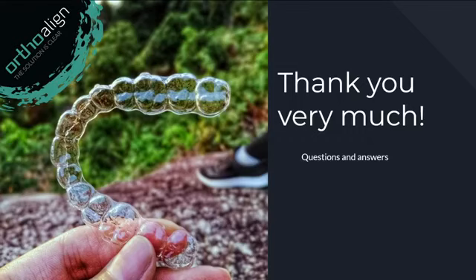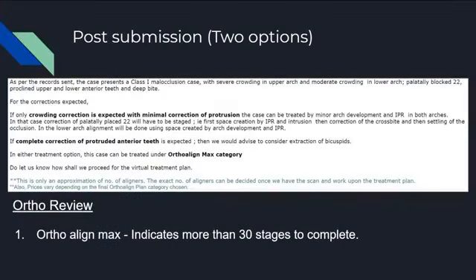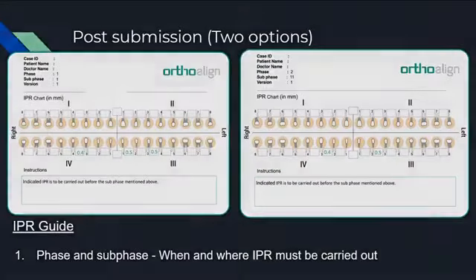Okay, so another question that we actually got here as well is, what is the difference between a free assessment and final treatment plan? A free assessment is basically the ortho review that I showed you earlier. Okay, so this is your free assessment or your ortho review. Okay, and then this is going to be your final virtual treatment plan.